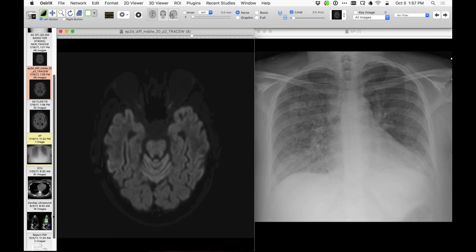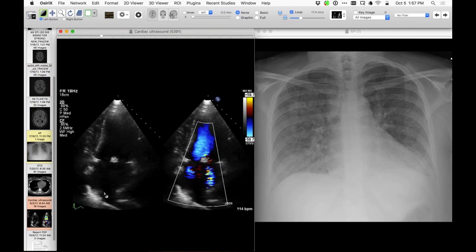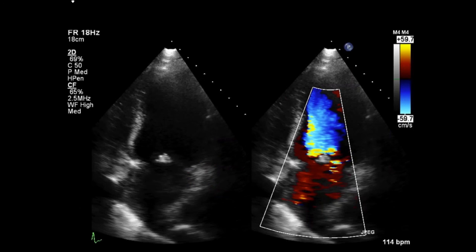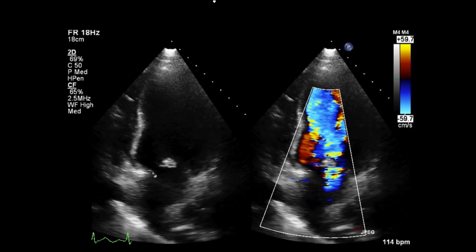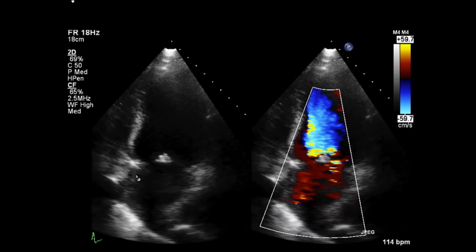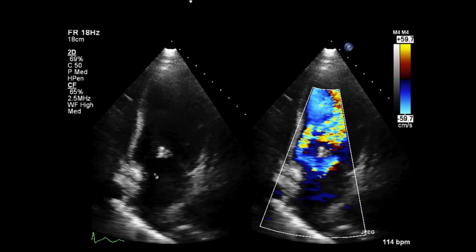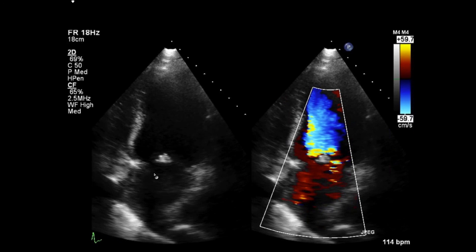And the source of that is what you see here in relation to the mitral valve. So here we have the atrium and the ventricle. And that's playing a bit fast, but here we have the mitral valve. So this clearly is very consistent with Libman-Sacks endocarditis, that non-infectious endocarditis of SLE, where you form non-infectious vegetations on a valve. In this case, I think it's perhaps most commonly the mitral, as far as I remember, with an embolic phenomenon to the brain.